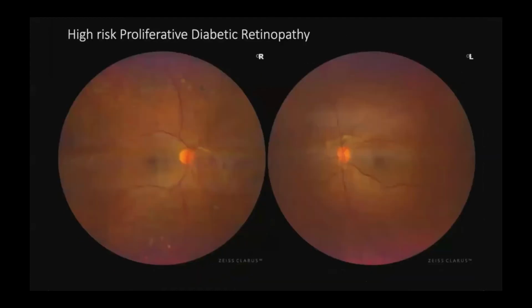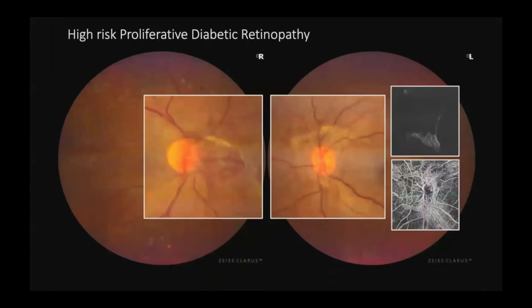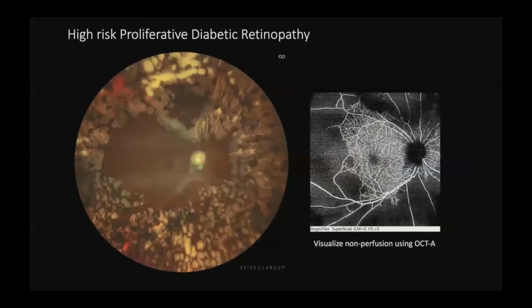In high-risk proliferative diabetic retinopathy, we can look here and see that there is significant neovascularization of the disc in both eyes. OCT angiography can also be used in this case to look more closely at the neovascularization and actually visualize these neovascular fronds coming up into the vitreous on the VR slab. High-risk proliferative diabetic retinopathy, here treated with panretinal photocoagulation, OCT angiography can help us to visualize areas of vascular non-perfusion and can guide additional PRP laser if needed.